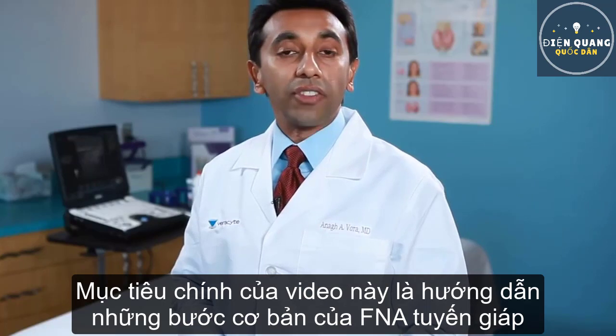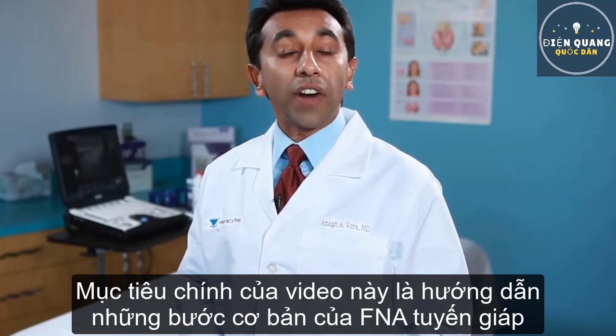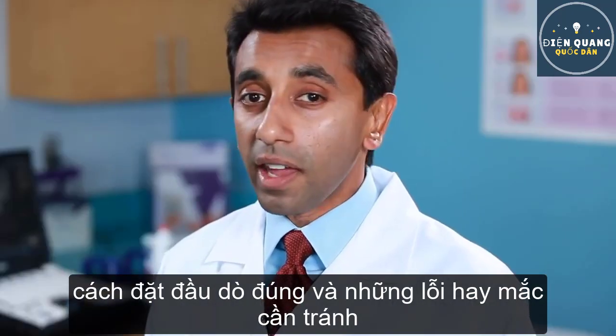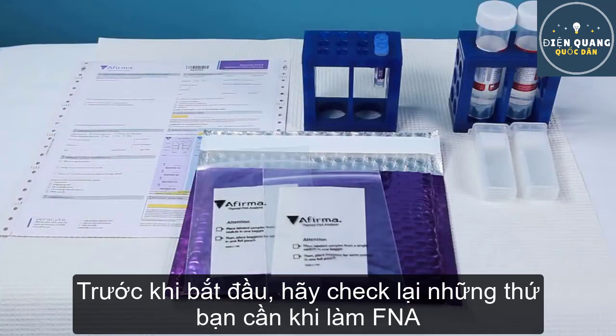I'm Dr. Nugvora, and the goal of this video is to review basic ultrasound-guided fine needle aspiration of the thyroid, focusing on proper technique and avoiding common errors. Before you get started, check that you have all the necessary supplies and have them accessible to you when performing the procedure.